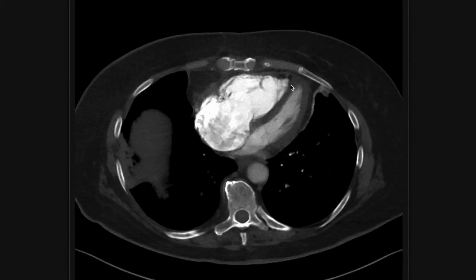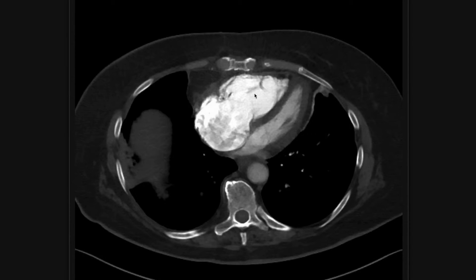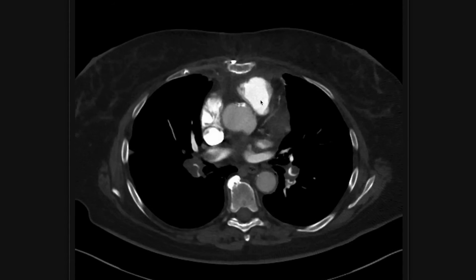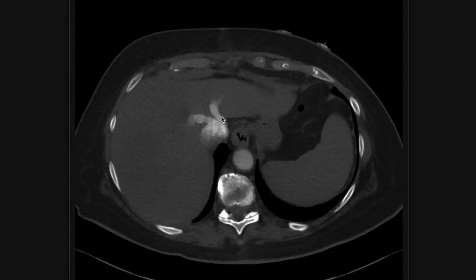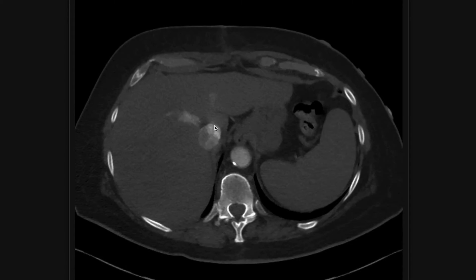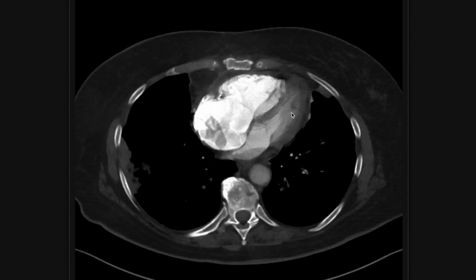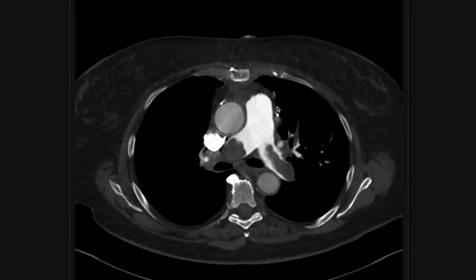Here's our interventricular septum. Do you see how it is bowed towards the left ventricle, which almost looks like it's being smushed by a big right ventricle? That is an imaging finding of right heart strain. That bowing of the interventricular septum towards the left ventricle, with a really big right ventricle — that is right heart strain by imaging. And see how there's contrast in the IVC? That's an indicator of acute right heart failure. So we have contrast in the IVC, a big right ventricle, and a flattened interventricular septum.